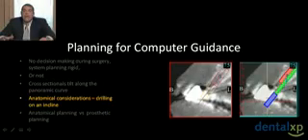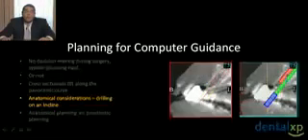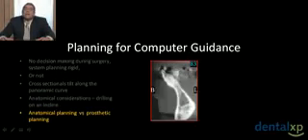We need to understand where we're drilling as we're drilling, so we may need to look at a procedure like this, that after we've created our pilot osteotomy, we may need to look at and see what the position is, decide if we want to maintain that position or modify it, or as we're drilling this, understand that there's the possibility of the burr skipping when drilling through a system, and so we need to orient our burr and be conscious to keep the burr on path.